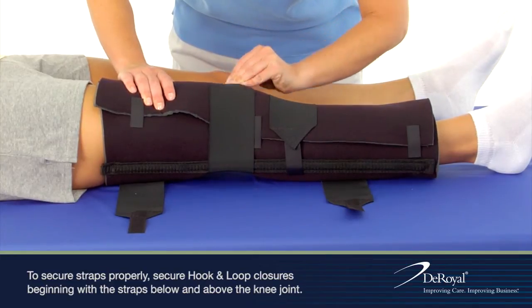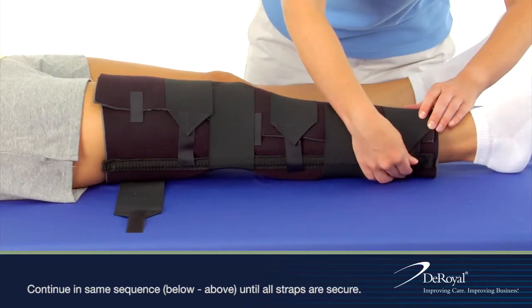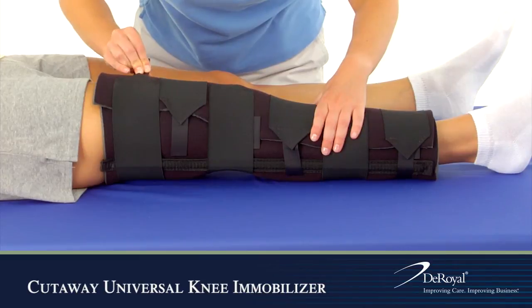Continue in the same sequence — below and above — until all straps are secure. Trim the straps for a more customized fit.